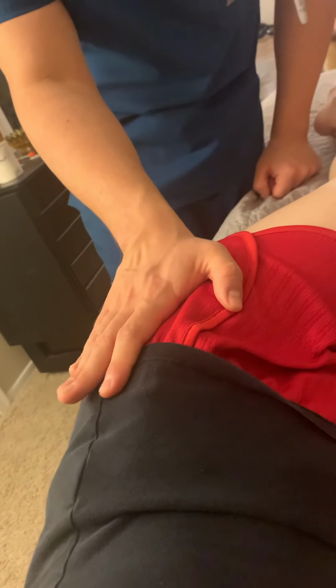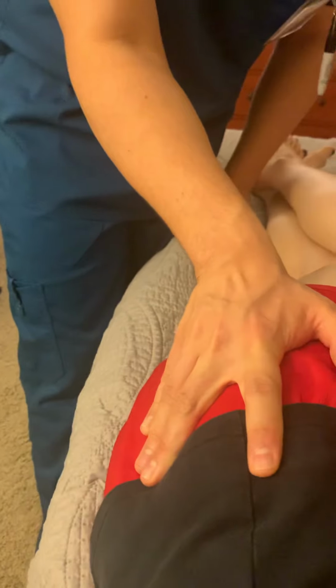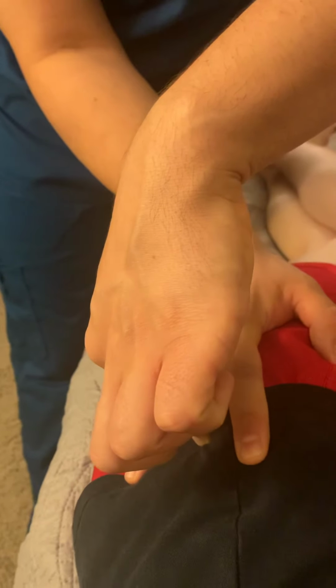Then next, we're going to have the ventrogluteal injection. Again, you're going to find the greater trochanter. This is going to be your major landmark. You're going to point your finger towards the anterior superior iliac spine, and then you're going to point your other 3 fingers towards the iliac crest. And where you've created this triangle, you're going to swab it and inject straight into the muscle here.